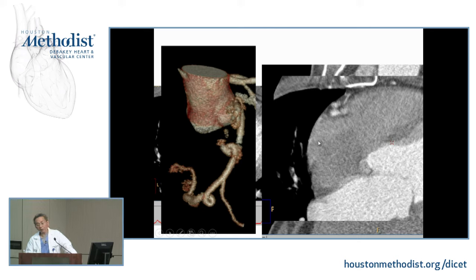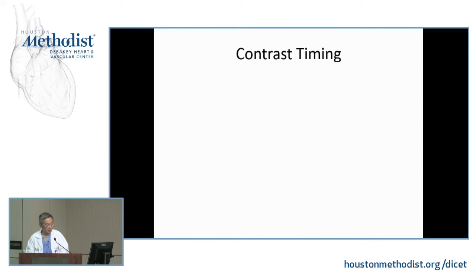You know, radiologists by training look at actual images. They just go down slice by slice, and if you look at this, you call this artifact. But for us, especially in this lab, I know you guys probably never look at the actual images. The first thing you do is jump in and start tracing the arteries. So it's kind of the other extreme. And studies have shown that the best diagnostic accuracy for interpretation of the coronary artery is a combination of interpretation of the actual images and MPR, okay? So for you, I call that a pseudo artifact.